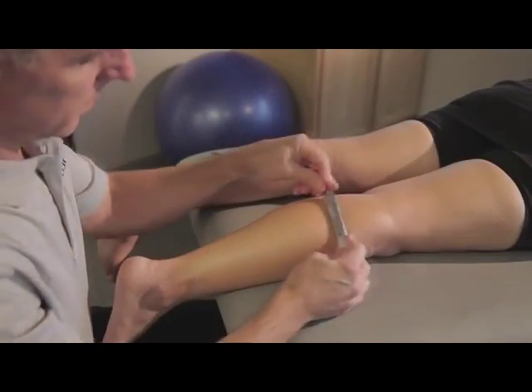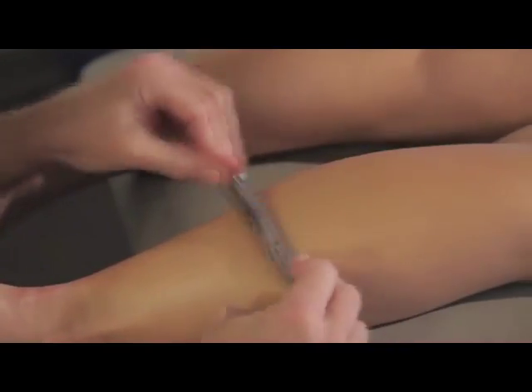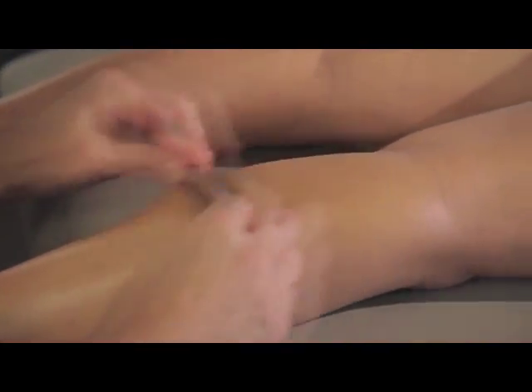Now the technique itself really does incorporate other things other than just the intervention with the instruments. We have patients warm up before they're treated. After the treatment with the instruments, we have our patients exercise. The instrument component, though, like I said, takes about 10 minutes.